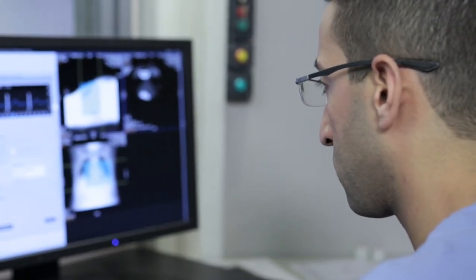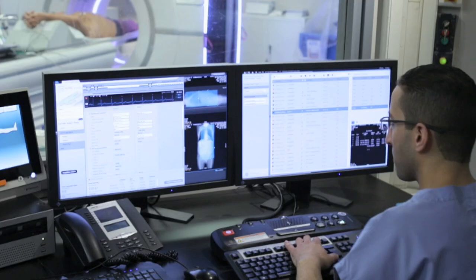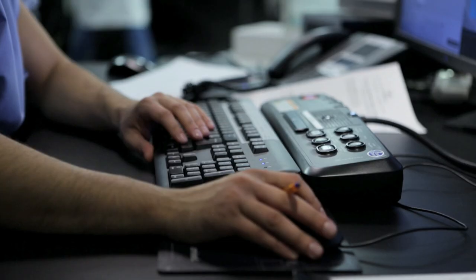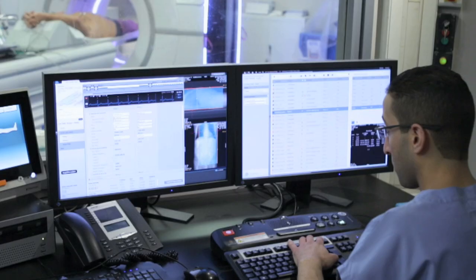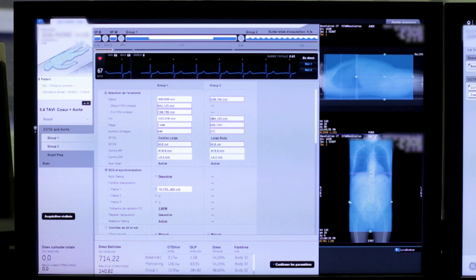For complex cases, such as planning for TAVI procedures, Revolution CT's combination of speed, coverage, and resolution help you image the entire aorta in only one contrast injection, typically in less than seven seconds.